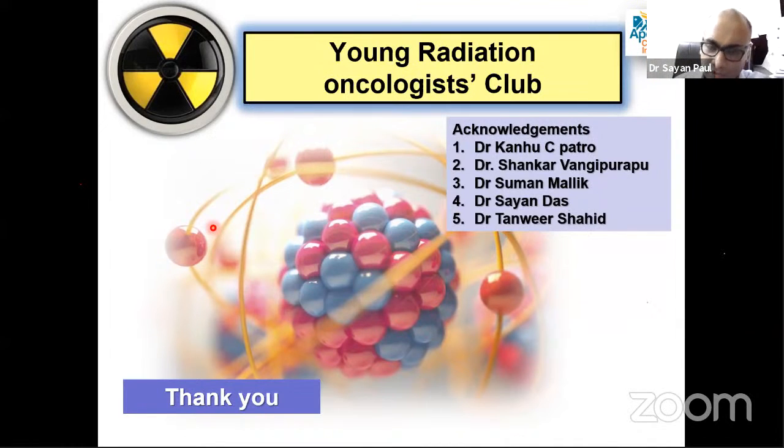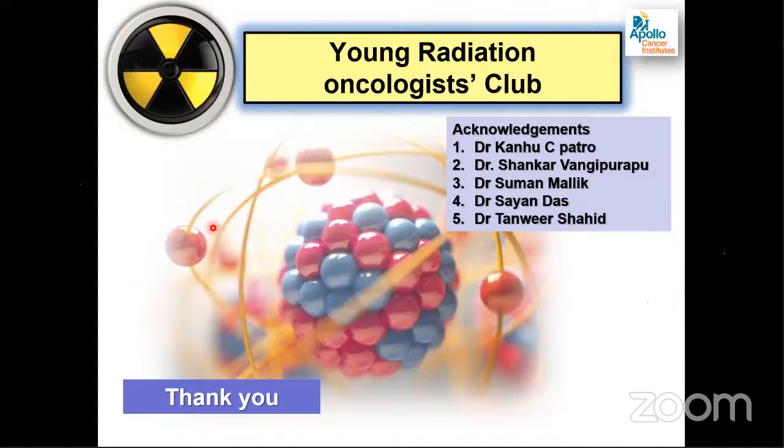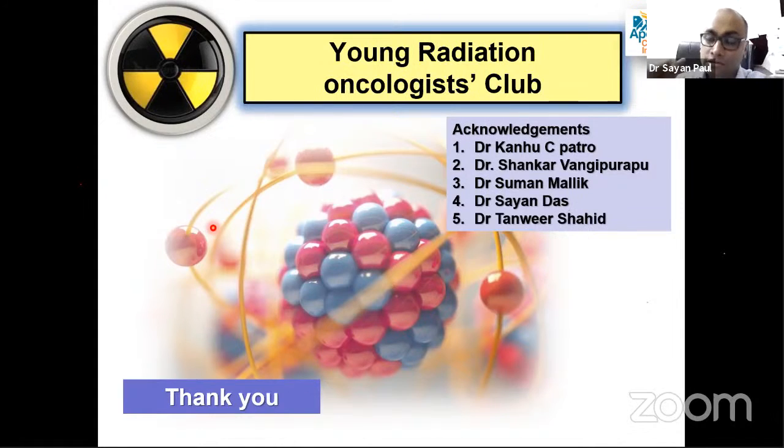And however conformal you be, at the end of the treatment, your uncertainties increase. So you can take intrafraction image very, very fast with the same accuracy as a CBCT image. And also during the treatment, while the beam is on, you can take image. No other imaging technique can take intrafraction image. So that is the advantage of ExactTrack.